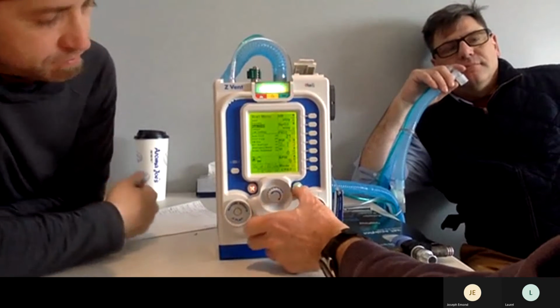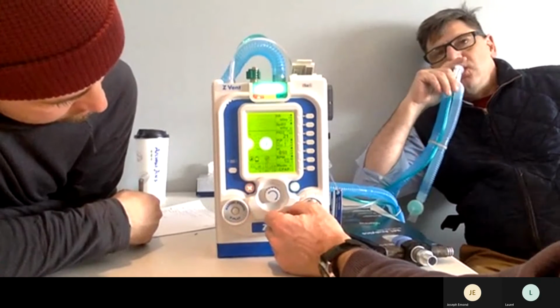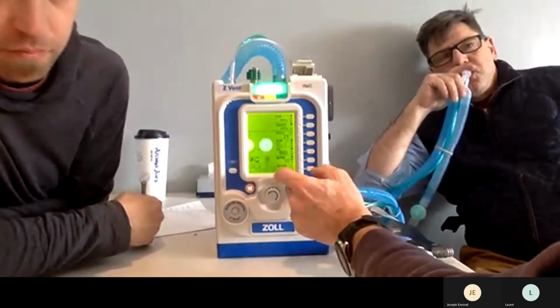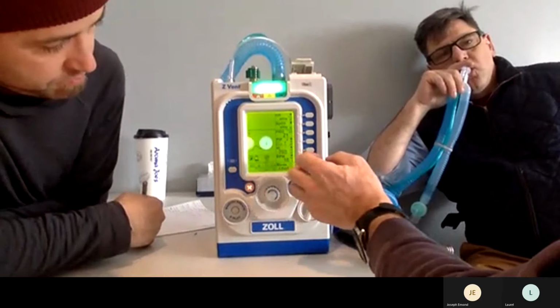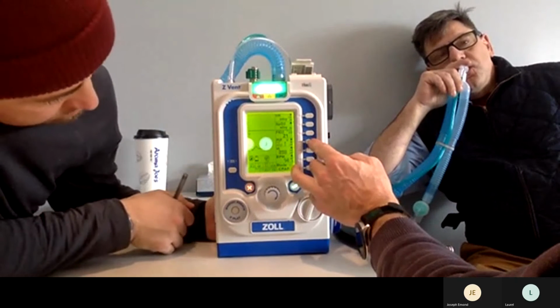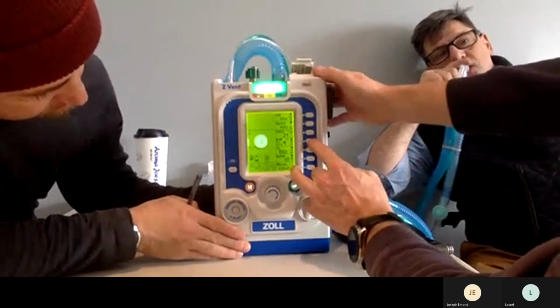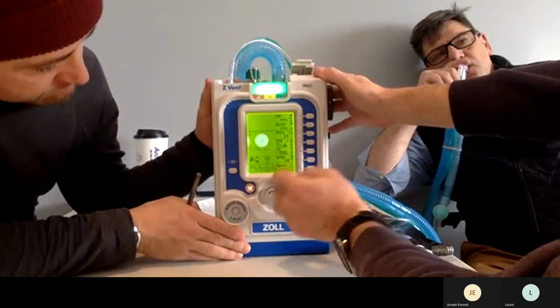Down to CPAP, green. Let me breathe a little bit. All right, so PEEP at 5. You said slowly go up with that to 9. So hit that until it shows peak. There you go.